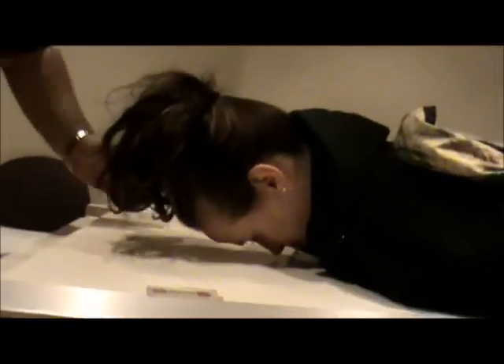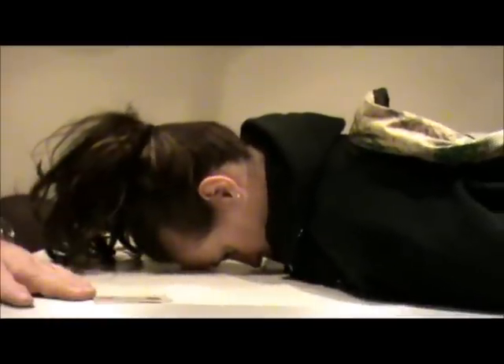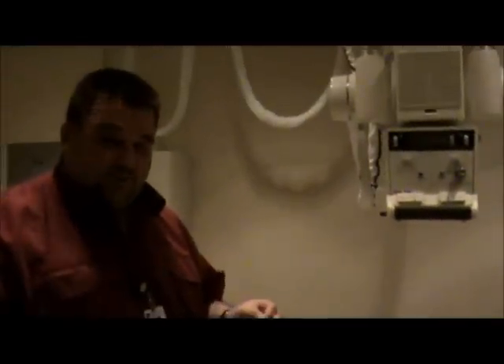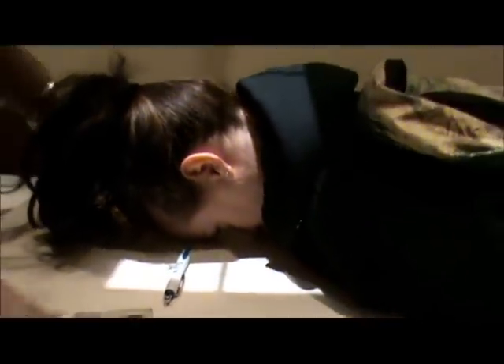We're going to have her put her forehead on the table and verify that her head is straight. We're going to use the orbitomeatal line between the EAM, which looks pretty straight. Our centering: instead of entering at the level of the glabella, we're actually going to exit at the level of the glabella. I'm going to use an ink pen to mark where that's at and open up my collimation just a little bit.